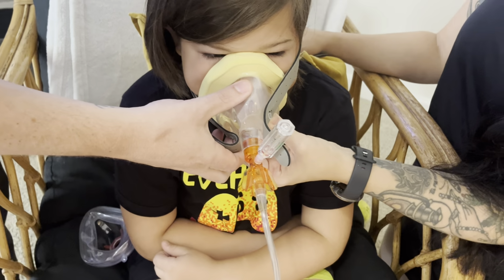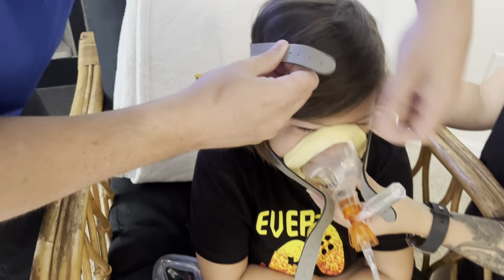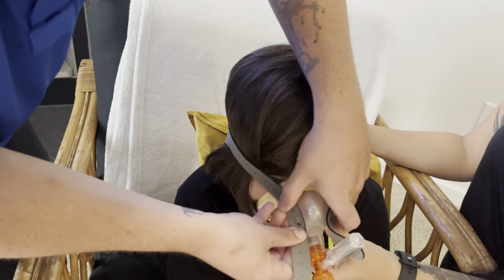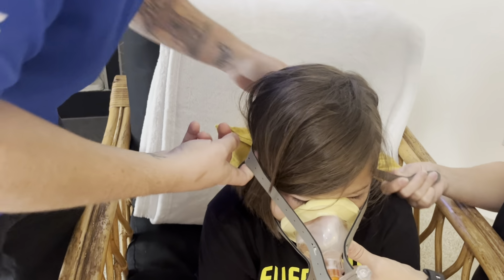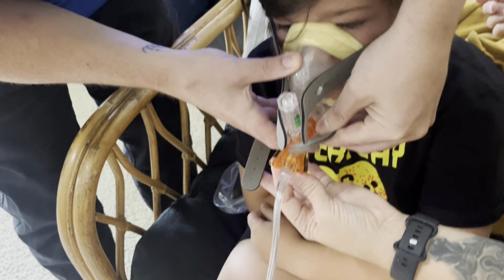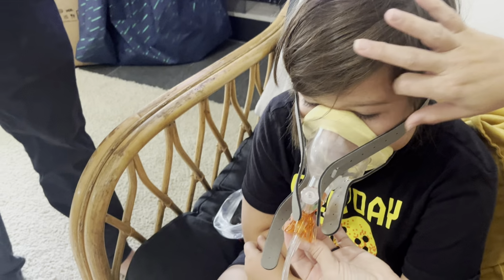And so she's going to maintain that seal. And then we're going to come up here and we'll put another top one on, right? Maintaining that seal. See, with all this extra movement while I'm placing it on him, we're getting movement in the mask. My wife is doing an excellent job of holding that straight and making sure that it sits good.